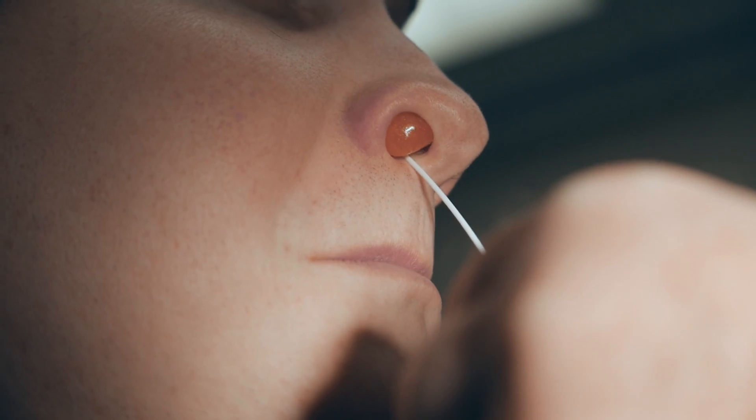Get it up there. That's as far as it's going to go. So the balloon blows up on the left here. We're going to slide it in, try not to make it sneeze, blow up the balloon, bring it out. So it slipped. That helps — I think it's actually better to consider this because if it slips off this unilateral balloon, then it doesn't come out. There we go, we've got it.